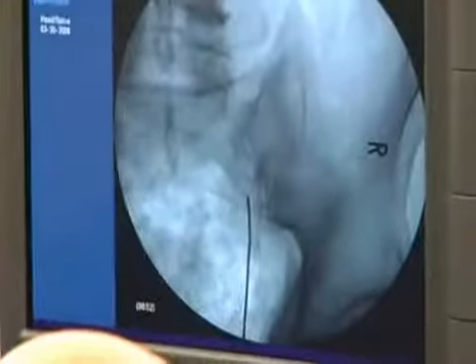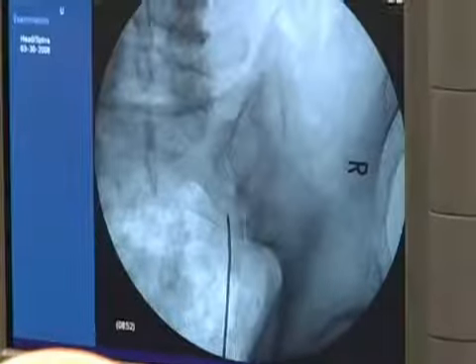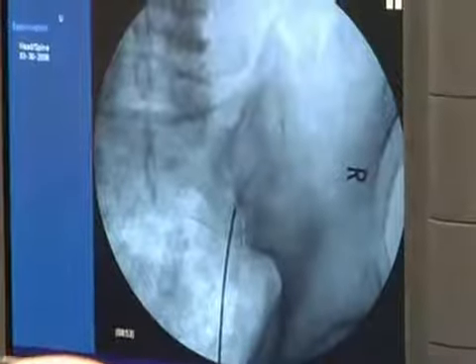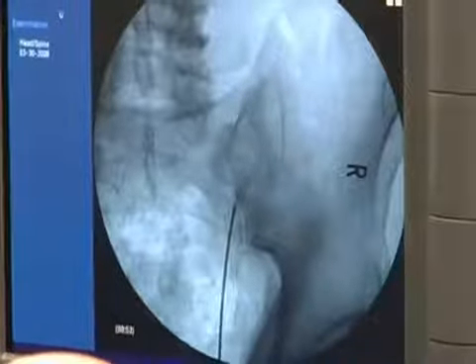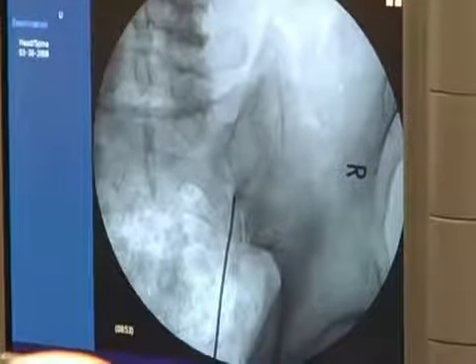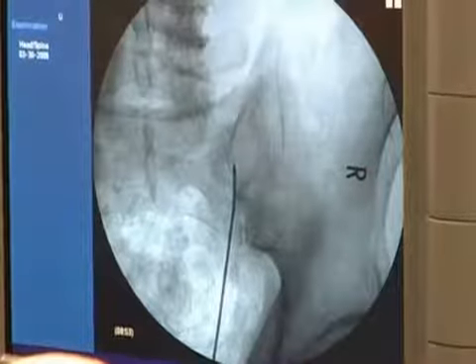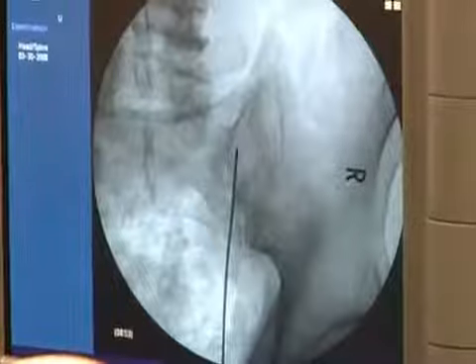Okay, so now we're advancing up a little bit further. You can see I rotated it the other way. So I'm just simply wiggling this along now. When you get it in this plane with this trocar tip, it goes so easily compared to the other one. I actually thought I had gotten too shallow with it. But now we're coming along again. I want to torque it down and make sure I'm on bone, so I put a little bend in it, just like we do with other needles, so I can get it to dive back down and touch periosteum. All right, now we're going to go medial. Okay, now I'm going to turn it lateral. Once you're here, it should go pretty easily until it just dives into the ala.